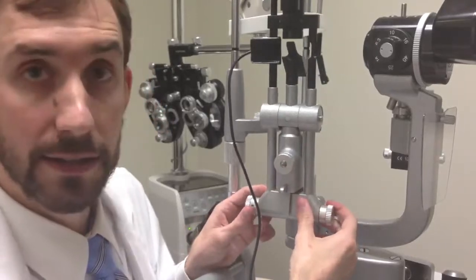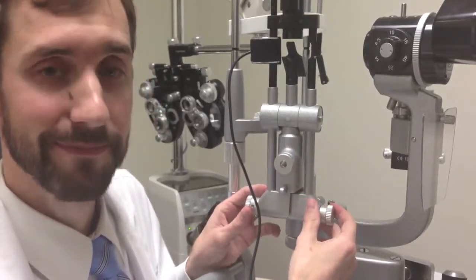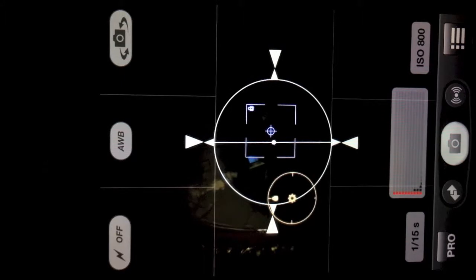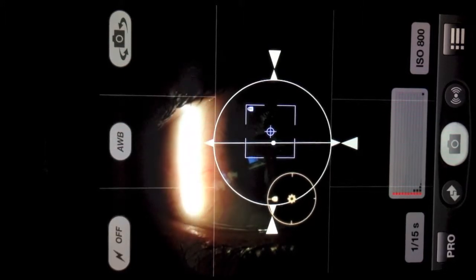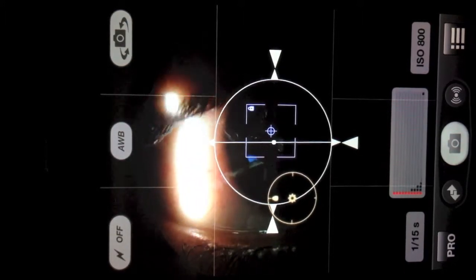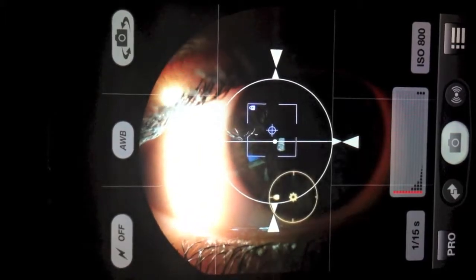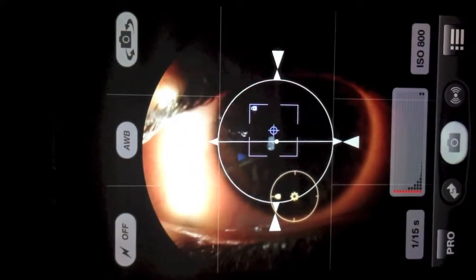to the left or right to de-center the slit beam. Second, focus a slit beam of light on a medium-intensity setting at the limbus of the eye.